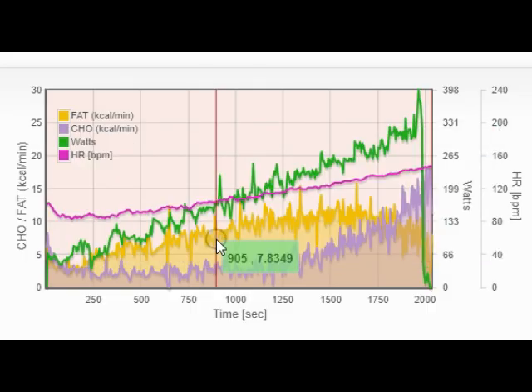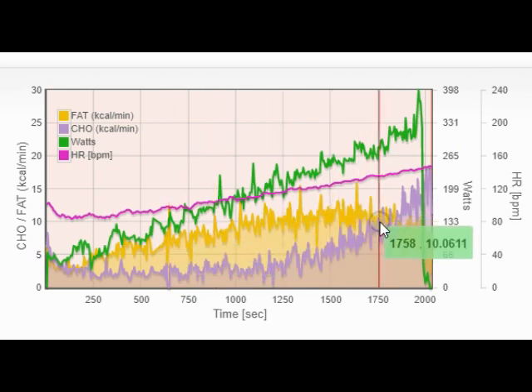Hello, I wanted to take about 4 minutes to show you a positive cardiometabolic crossover test, to find out where your metabolic crossover occurs, what corresponding heart rate, what corresponding power output. Let me just introduce you to CPET and CPET protocol here at M360 Clinical Fitness.